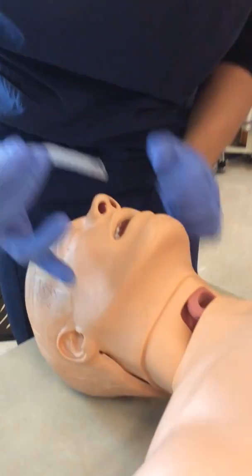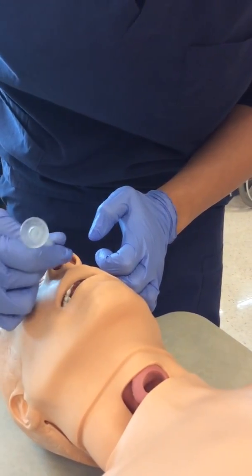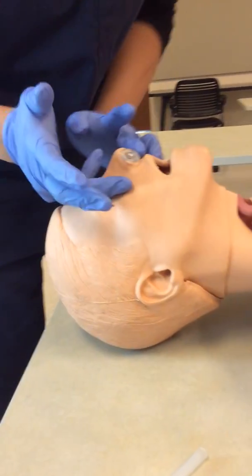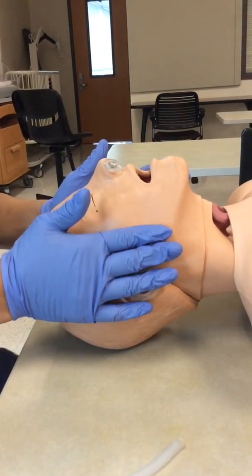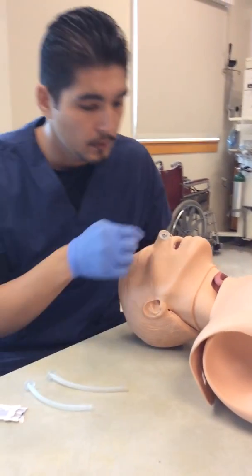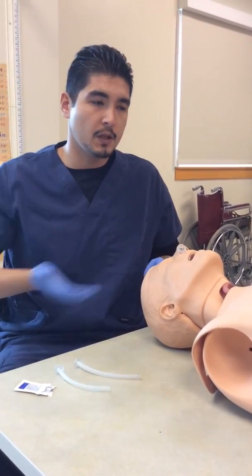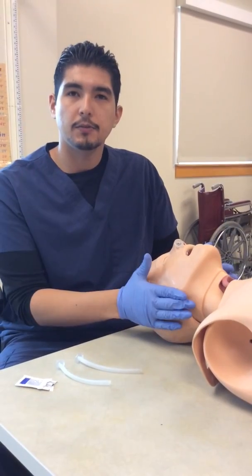And the way you want to insert it is bevel towards the septum, and it should just slide in place and lay flush here on the patient's nose. And that's how you insert an NPA. You also want to make sure you take note of the size of your NPA, so you can go ahead and chart that, as well as chart what time you inserted it. And that's how you insert an NPA.